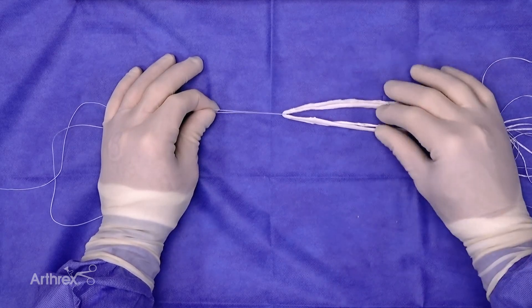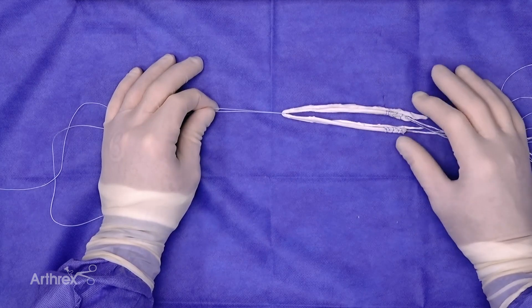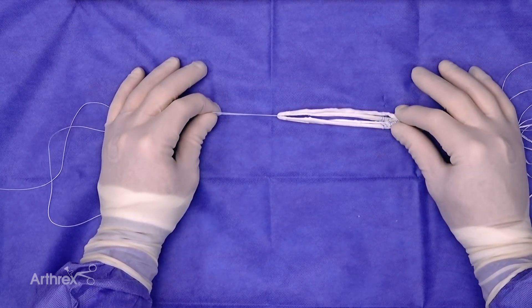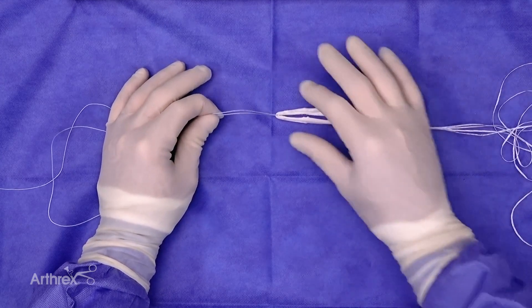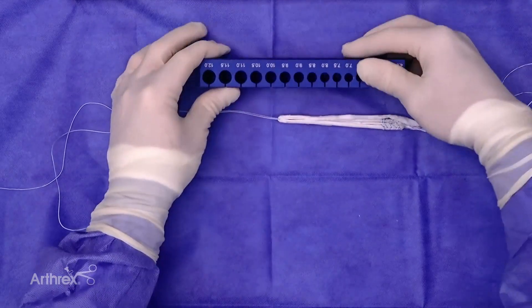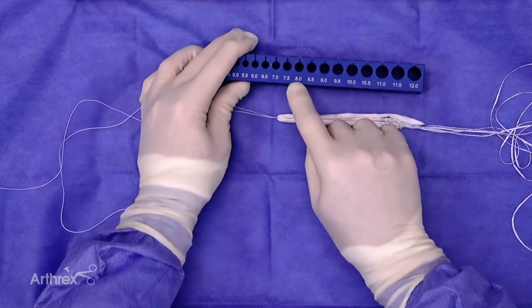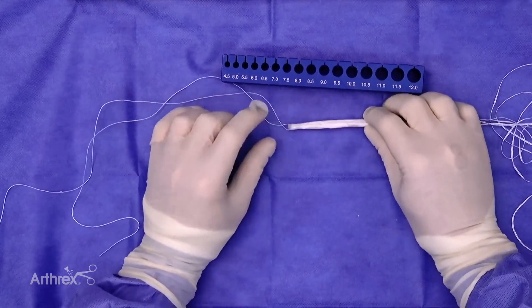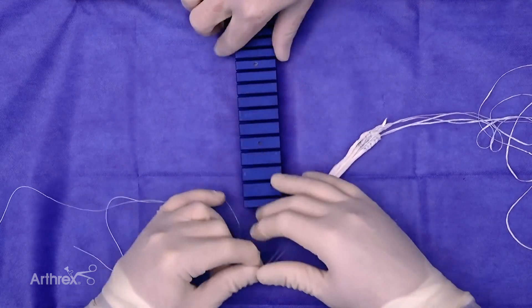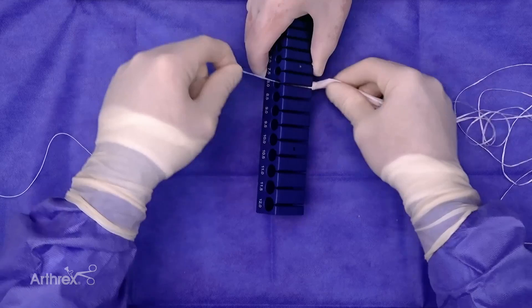Today we're presenting a technique in which a quadruple hamstring autograft harvest is obtained with the goal of performing an ACL reconstruction with hamstring autograft. Not infrequently, intraoperatively, it is encountered where the hamstring quadruple autograft is not as thick as is necessary. We know that an 8mm diameter is necessary for an individual to have a low re-rupture rate. However, at times, the quadruple autograft is not as thick as you would want in diameter.